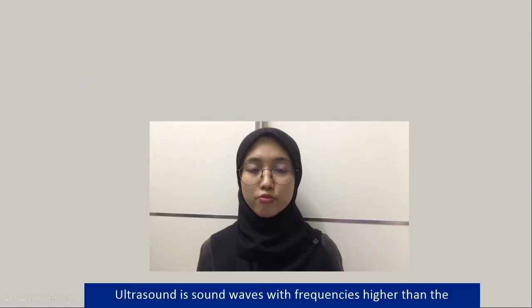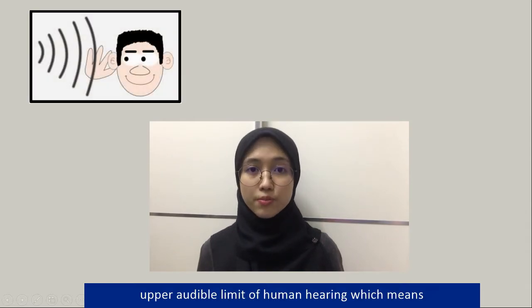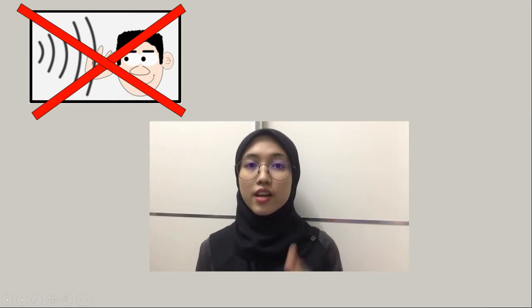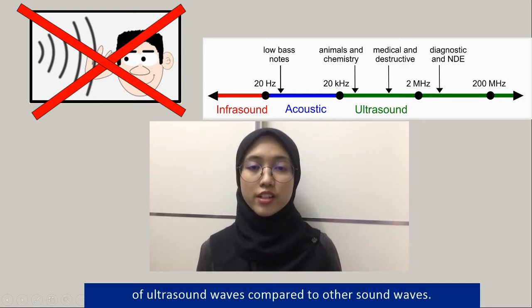Ultrasound is sound wave with frequencies higher than the upper audible limit of human hearing, which means humans can't hear it. It has frequencies higher than 20 kHz. In this line range, you can see the frequencies of ultrasound wave compared to other sound waves.